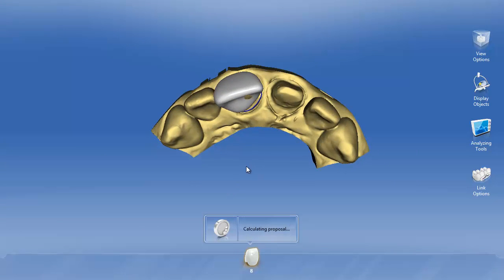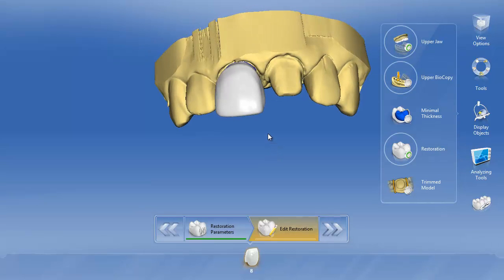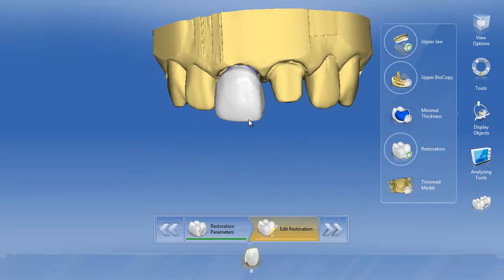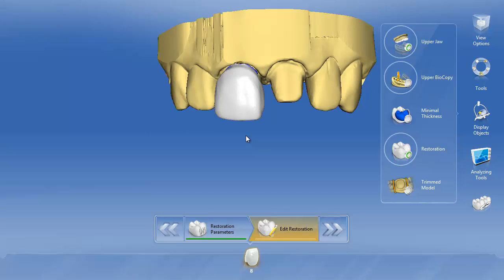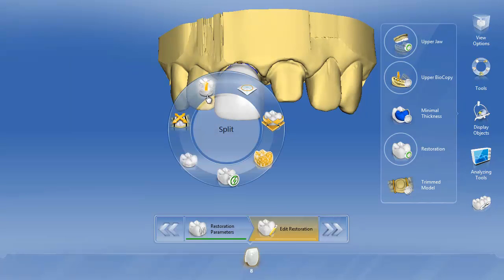What will appear is a typical biogeneric copy crown. Normally I would be doing tooth nine at the same time — I'm just doing a one-tooth example. You'd go ahead and finish up your design; you might obviously want to fix the midline here. Once your design is complete — whether it's biogeneric copy, biogeneric, or biogeneric reference — we're going to right-click and tell the restoration to split. This is going to create the multi-layer restoration.